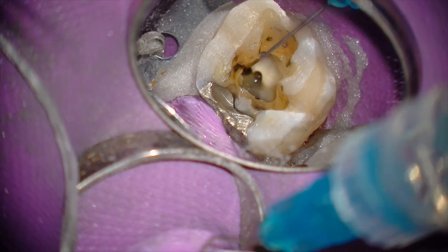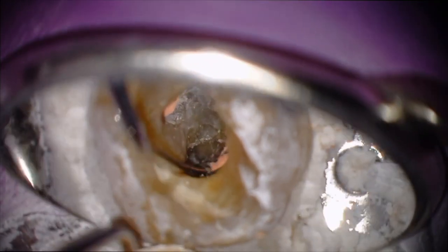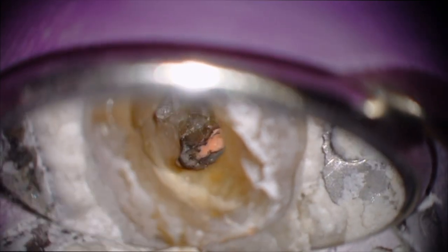Well, I had a question from Huma asking about the balance force technique and preparing canals, for example a distal mandibular canal, with hand files larger than a ProTaper F5, because the F5 wasn't large enough. Let's go ahead and take a look at what he's talking about.